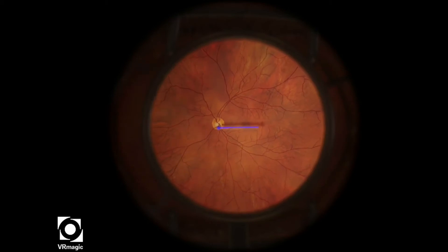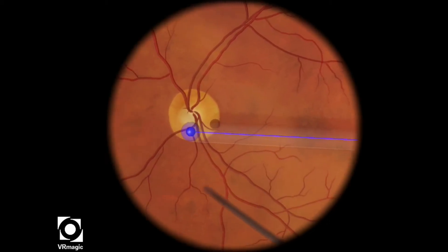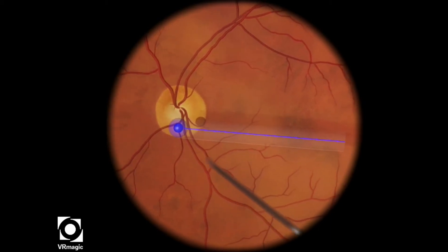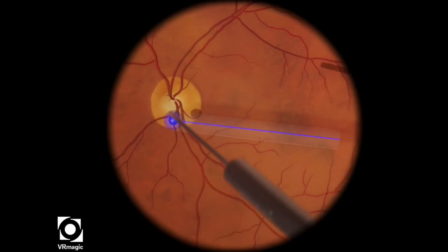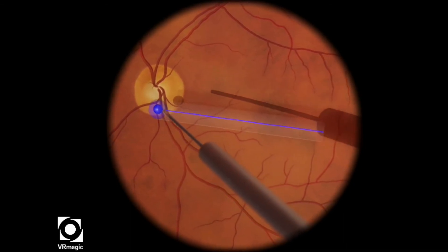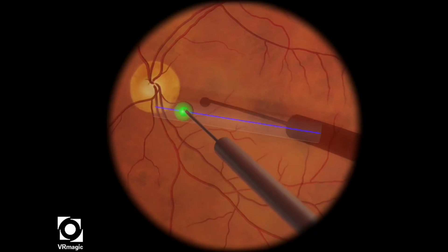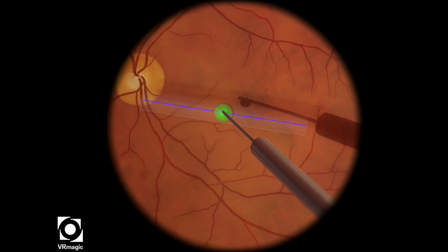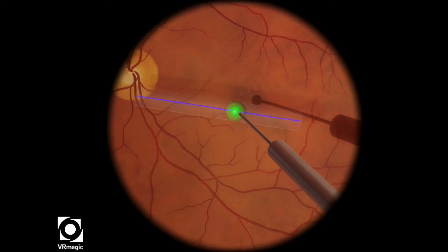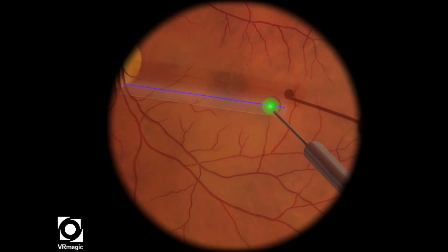At this particular level, your job is to use your instrument in your dominant hand — in my case, the right hand — and guide the sphere in a straight line along its path. I like to use the higher magnification, so a 90-diopter lens for this particular level, and my other tip is to try to stay as still as possible with your left hand, which is holding the light pipe.